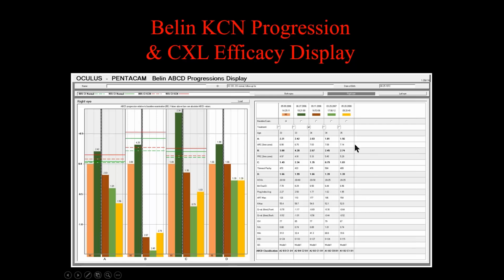On the right side, the tabular, we list a number of parameters people have used in the past to follow progression, just in case you're doing a study. So we list again, this is the A parameter, this is the grading, that would be what basically you see in that graph. This is the actual radius of curvature.